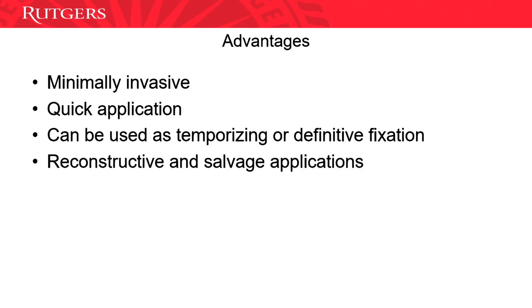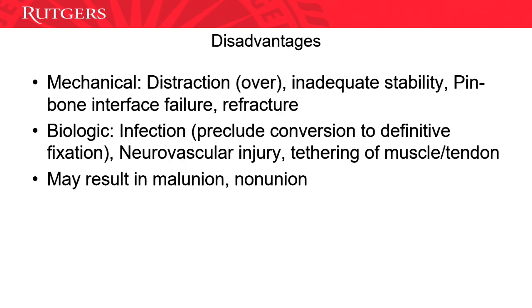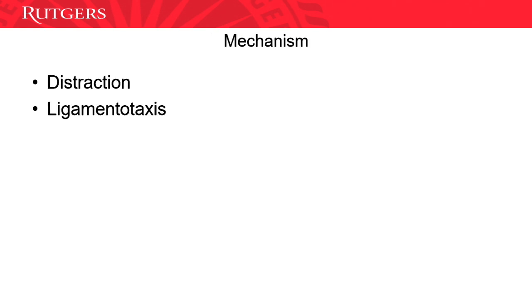It's reasonably quick application, minimally invasive, more in the lower extremity. The upper extremity, I think, especially in the humerus, try to make a bigger decision, especially if you're not sure or if you haven't done enough of those. And disadvantages, you can over-distract. Stability is inadequate, you can get infections, so they can be mechanical, they can be biological, it can cause malunions and non-unions. The main mechanism in the upper extremity is to get distraction to some extent and ligamentotaxis.